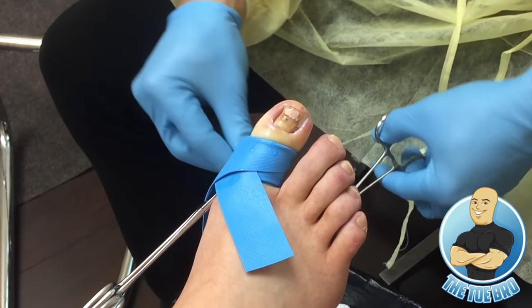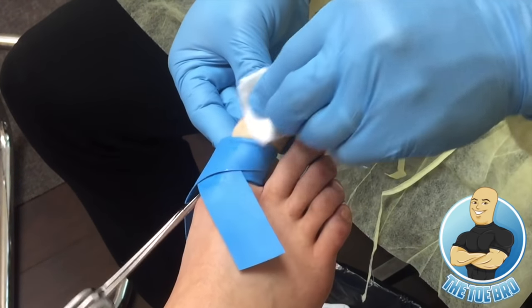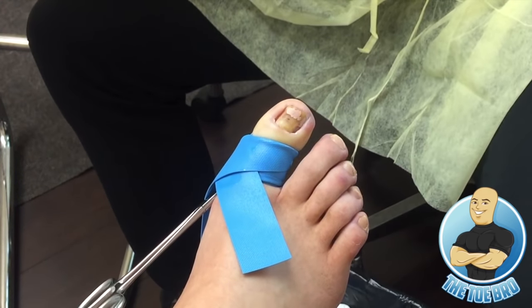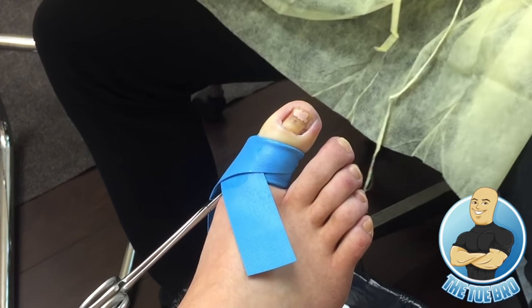Once the reaction has stopped, we'll be dressing the toe with a betadine solution. This is antibacterial and it helps dry out the wound. A few pieces of gauze and then a self-adhesive wrap.